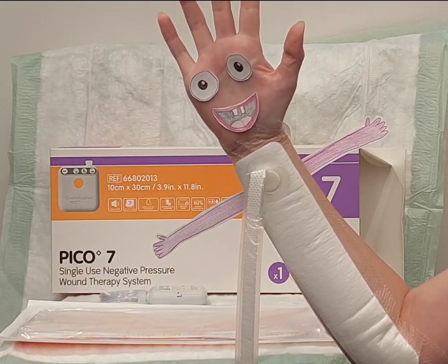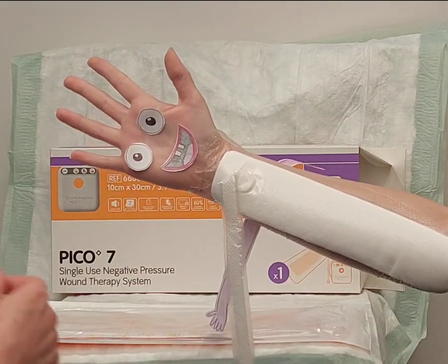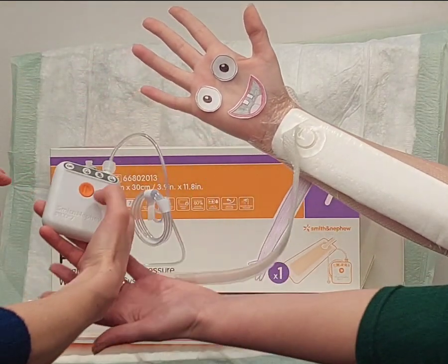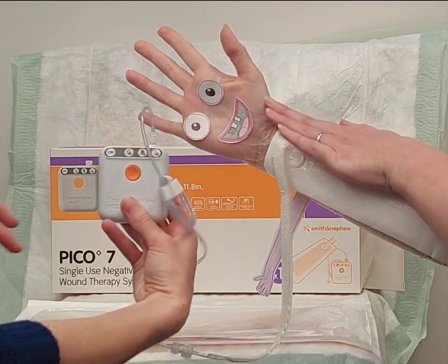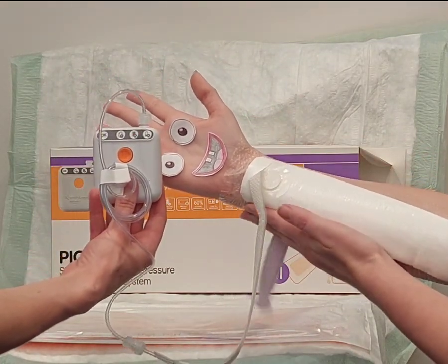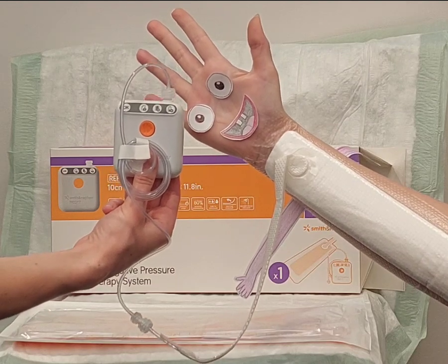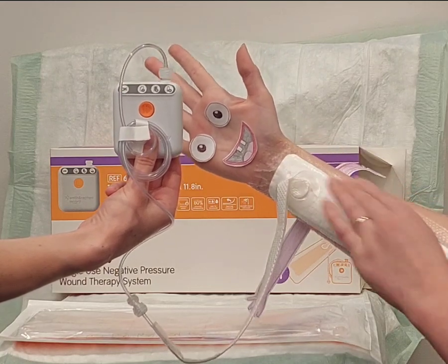Once the dressing is in place, you can connect the pump to the long tubing. Then press the orange button to start. You do not need to change any of the settings on the pump. The pump should be checked periodically to ensure the green light is flashing. This means it's doing what it should.